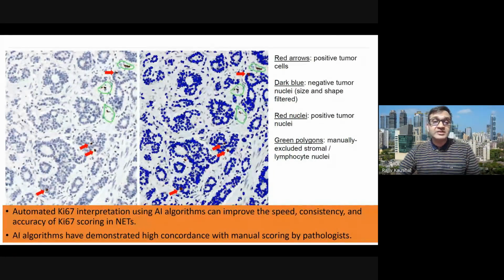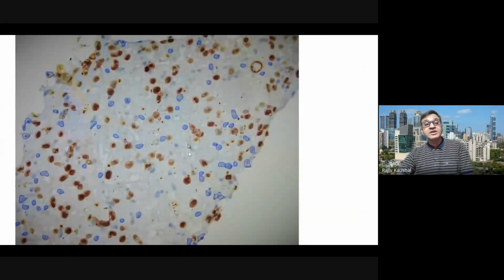These image analysis software can give more precise evaluation of the Ki-67, and so it is very much relevant for the neuroendocrine tumors and even in breast cancer. But one thing, if you use these algorithms, you have to keep in mind that for Ki-67 the staining intensity is variable. It can be either dark or it can be light brown.